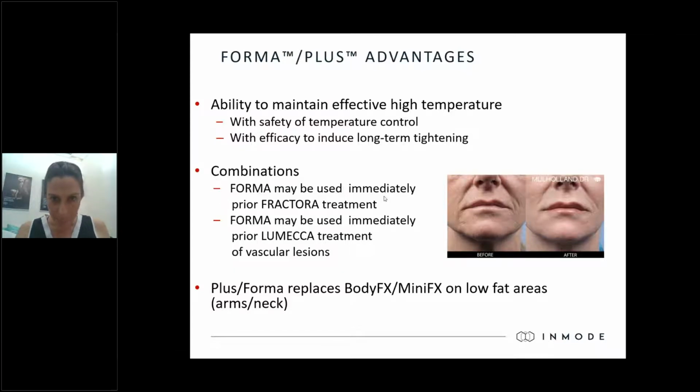We have a few questions also about fillers and Botox. Does it damage the fillers? There is a possibility that it might damage the fillers. We did not study that. We did not test that. And we do heat up the tissue quite extensively. So don't do that.